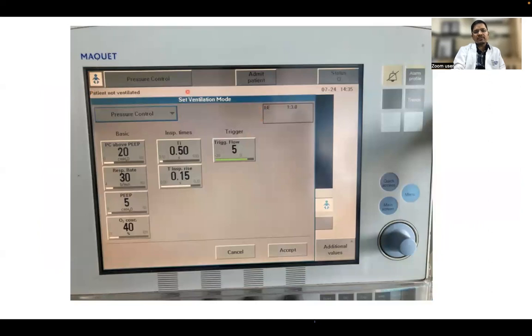So whenever we start the ventilator, there are various knobs. These are the monitor knobs. By rotating the knobs, we can change all the values. In pressure control ventilation, which we'll discuss later, we generally control the pressure. Otherwise, we control the respiratory rate. We set the PEEP, set the FiO2, set the TI, and the I:E ratio is automatically set.